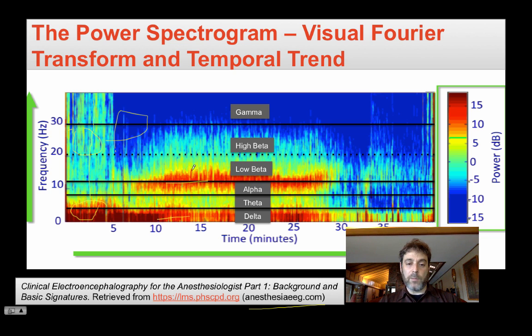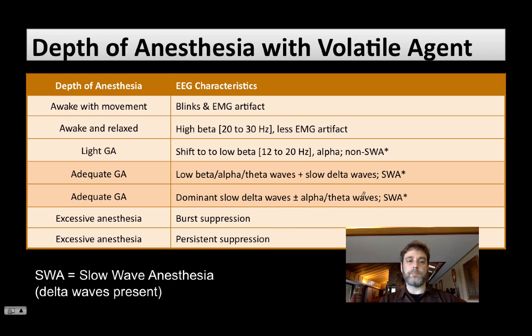And here there are both low beta and high alpha components. So sigma spindles and alpha spindles, there isn't really the same density of theta waves. And then here you have delta waves, and this is with emergence from anesthesia, your loss of your spindles, decrease in the delta density, and then the reappearance of your high frequency waves.